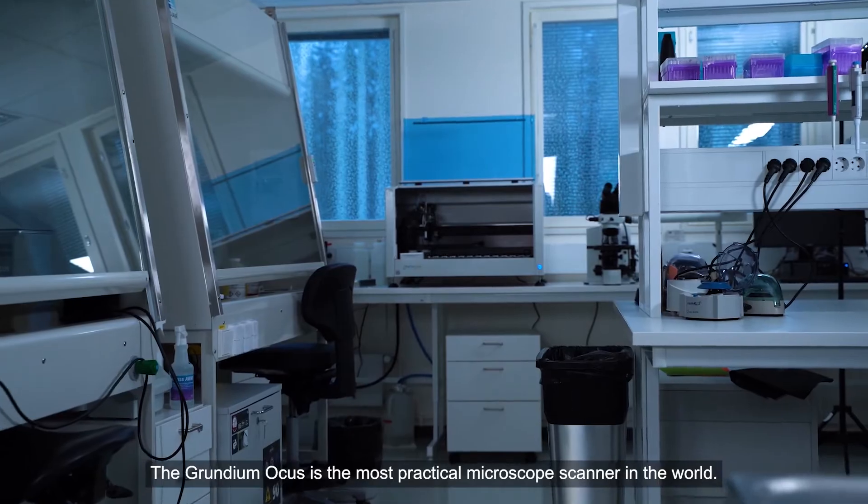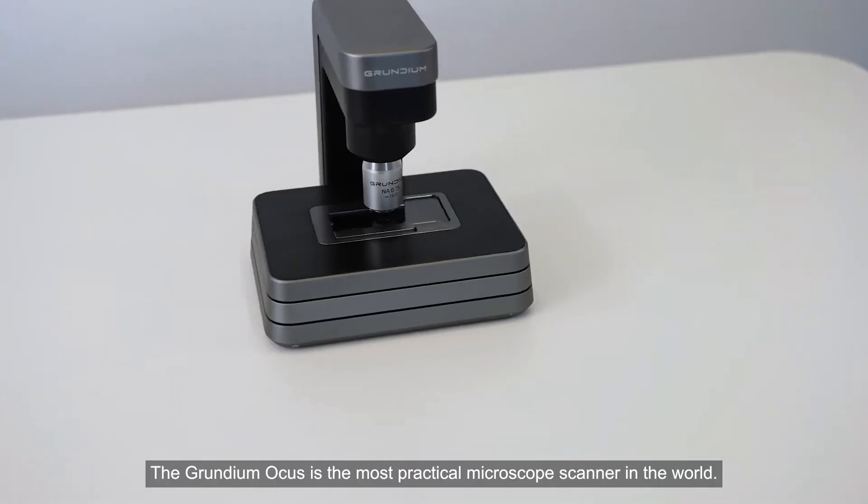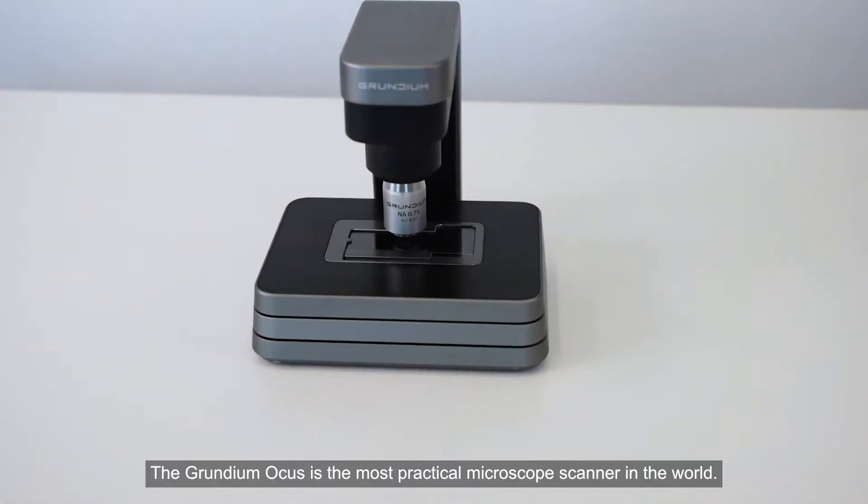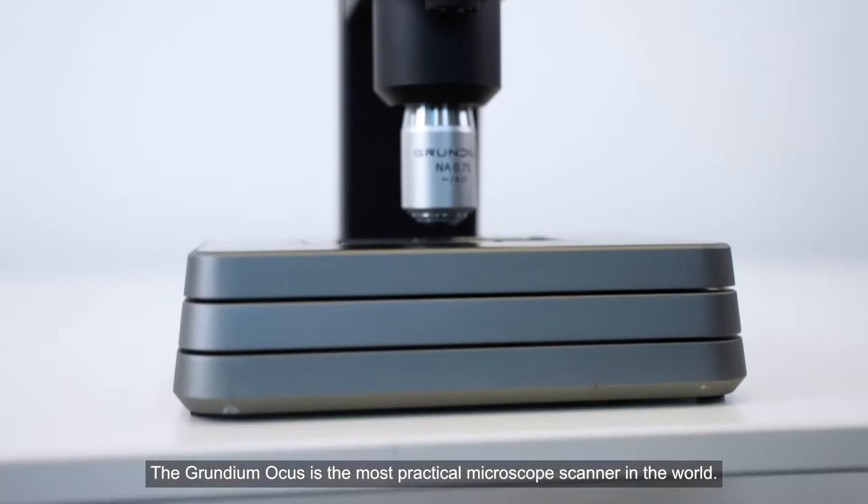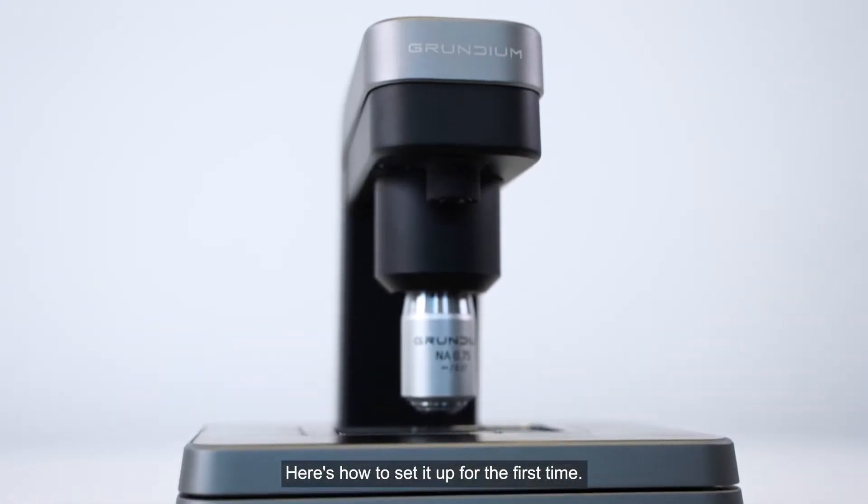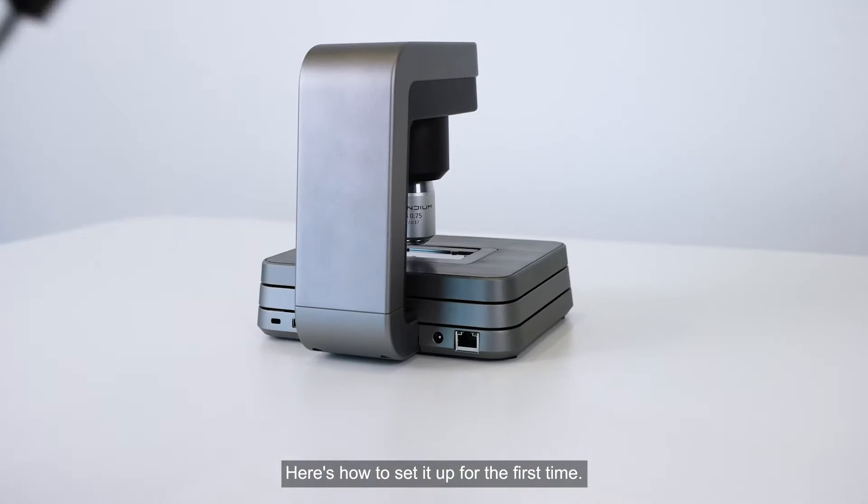The Grundium Ocus is the most practical microscope scanner in the world. Here's how to set it up for the first time.